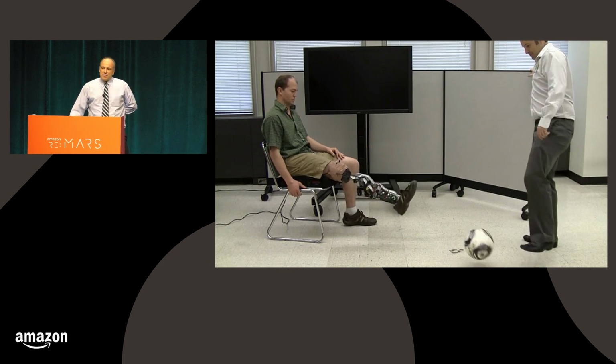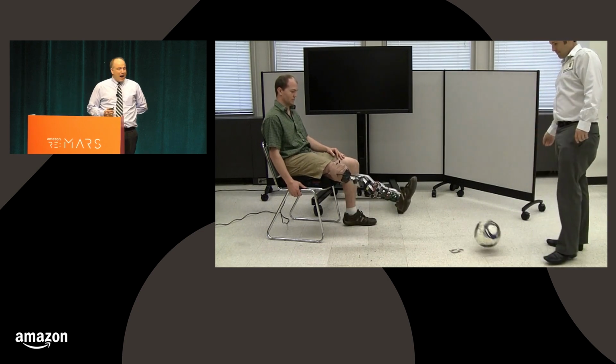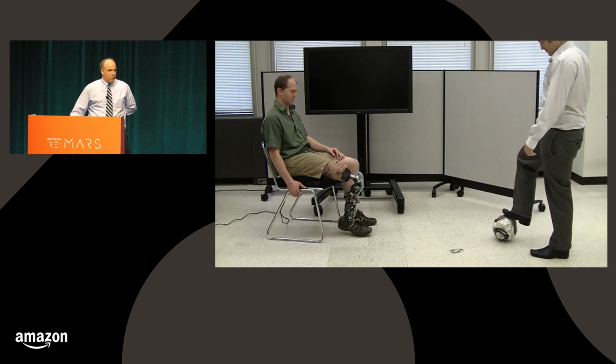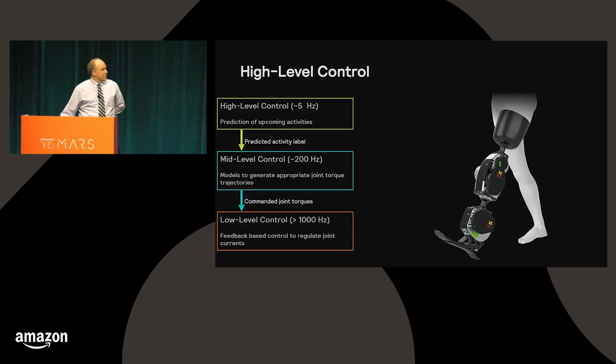Unfortunately, walking is different than just sitting in your chair, repositioning for comfort. It has to be highly accurate, and the best systems that we have just simply cannot do this in real time, continuously at the knee and ankle to decode all of the movements. So that brings us back to the control strategy that Dr. Rouse introduced earlier, and he went over the low-level control, the mid-level control, but I really want to focus on the high-level control and how that kind of interacts with the mid-level control.